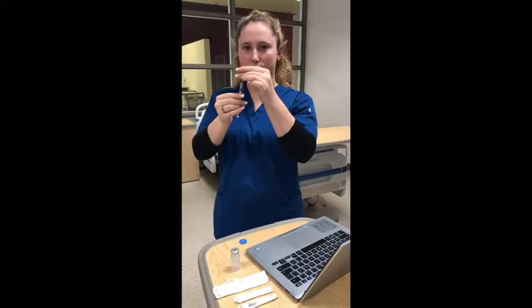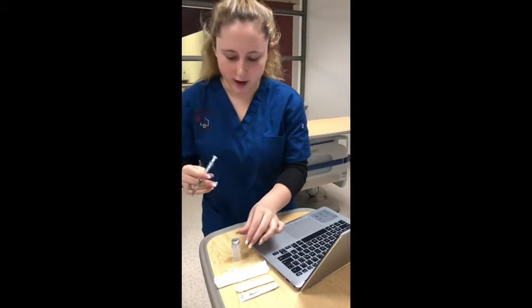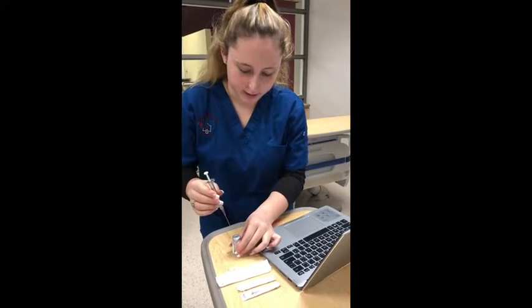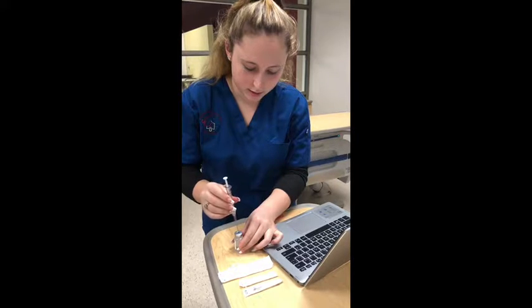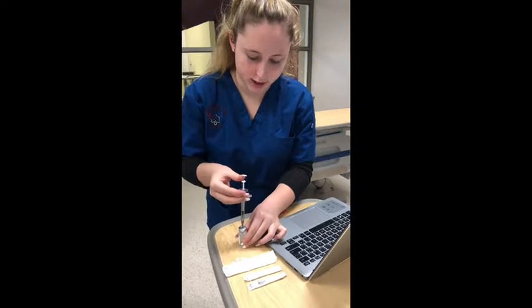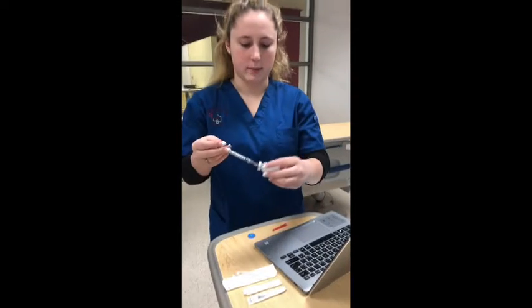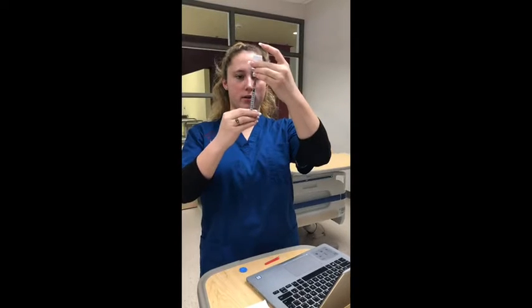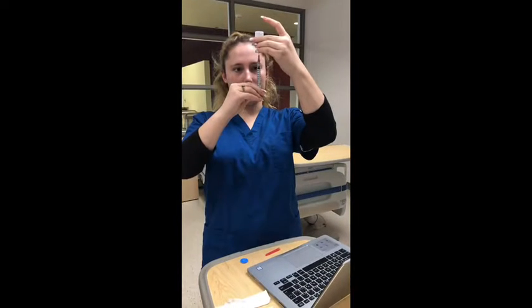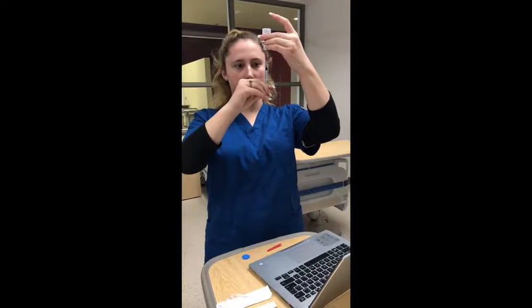And then I'm going to safely remove the cap. And I'm going to grab my vial and insert the needle into the vial. And I'm going to push the air in. And I'm going to turn it upside down. And then pull the 0.25 milliliters of the medication into the syringe.